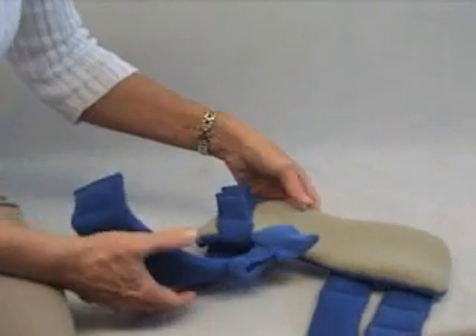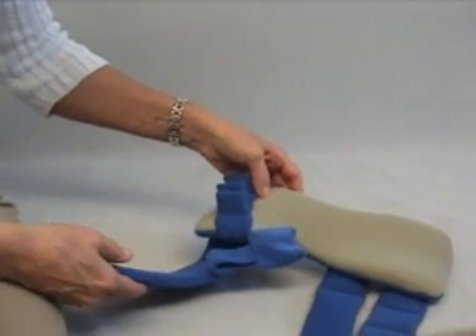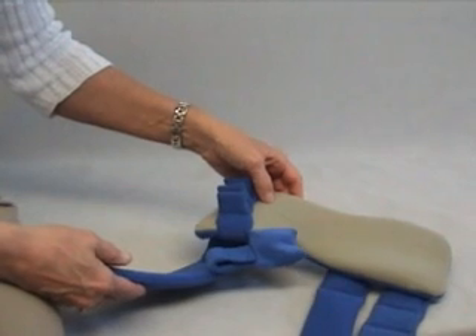Just remember to be very slow. These are restorative patients and their thumbs are very tender.